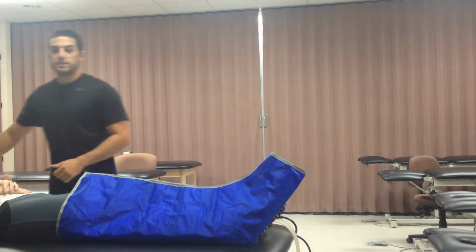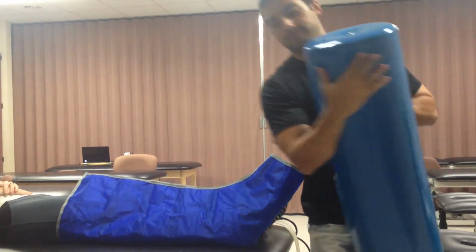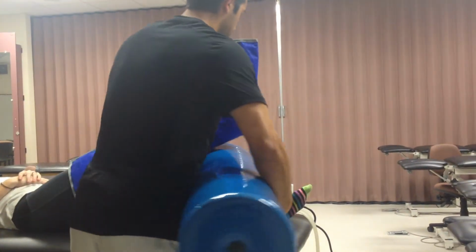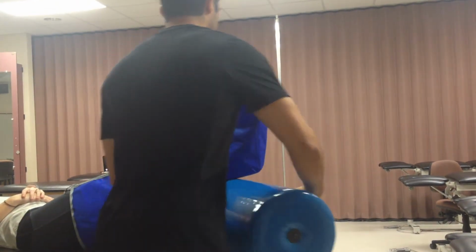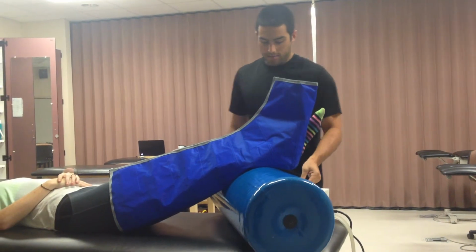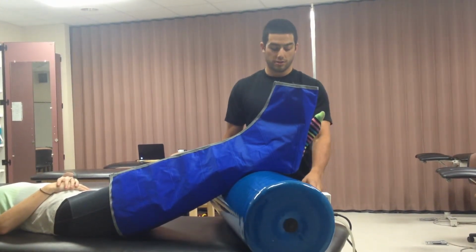For this treatment, the patient is in a supine position with the leg of the treatment slightly elevated. So I will put a bolster underneath to elevate the leg. I will then set up the parameters for the treatment on the compression unit.